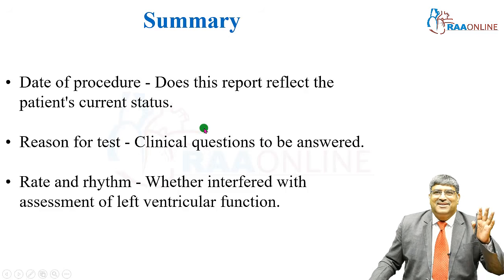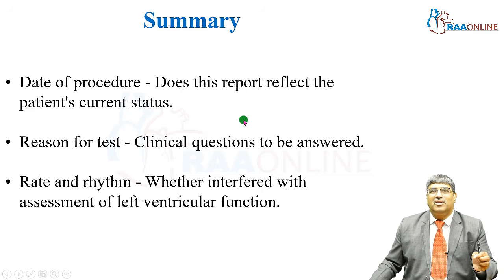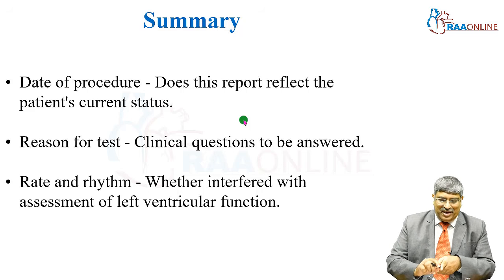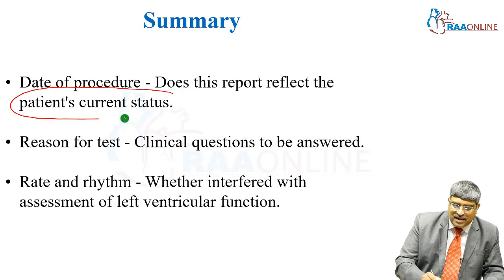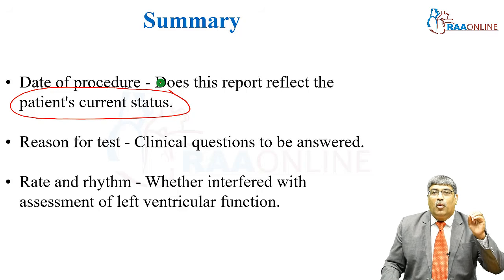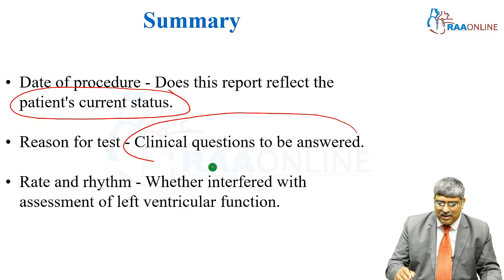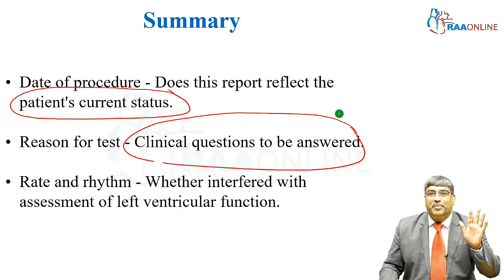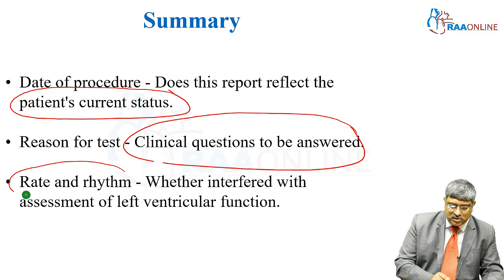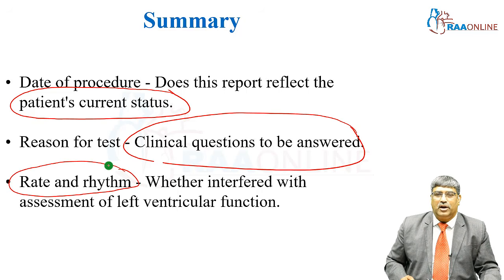To summarize, first thing is you look whether the patient report reflects the patient current status. Clinical examination is very important. And why you ask for echocardiogram? The questions should be answered. Whether the patient rate and rhythm was normal when you are doing the echocardiogram.